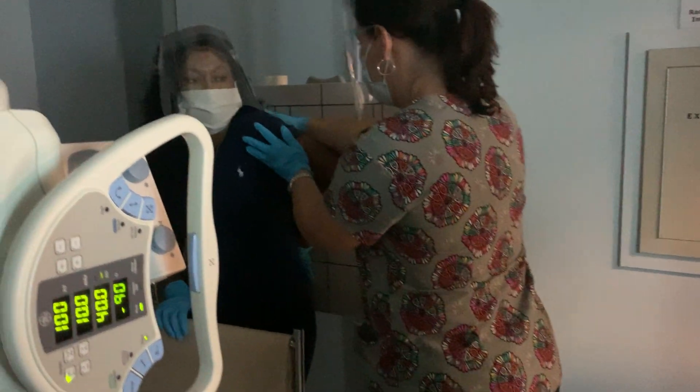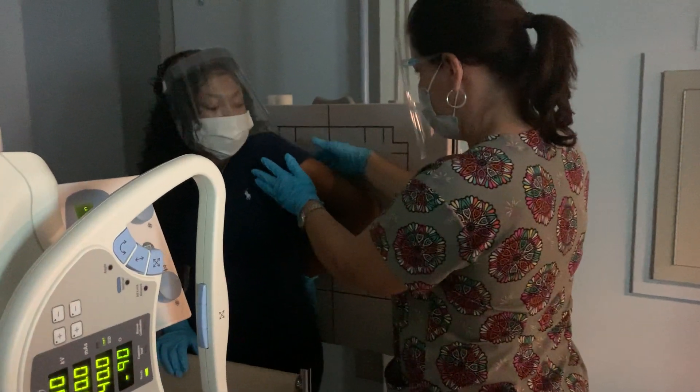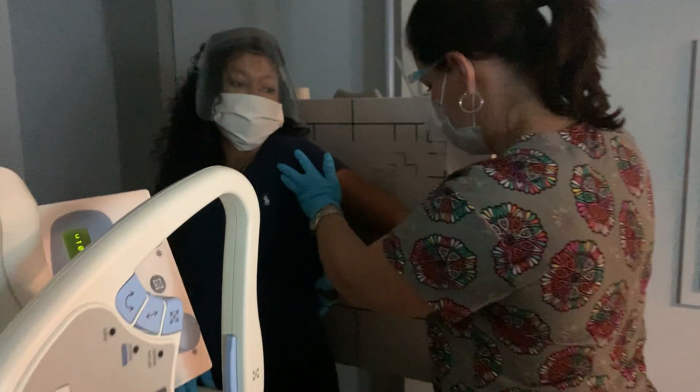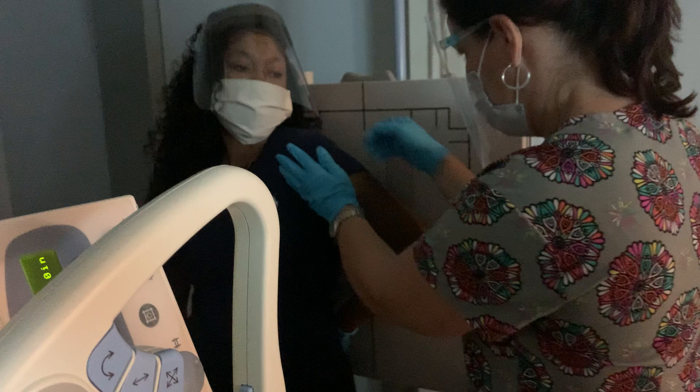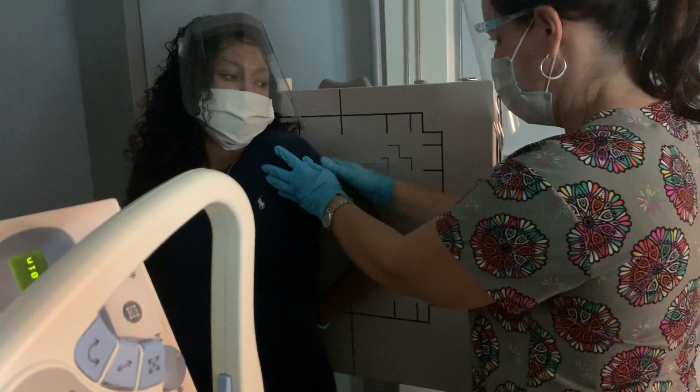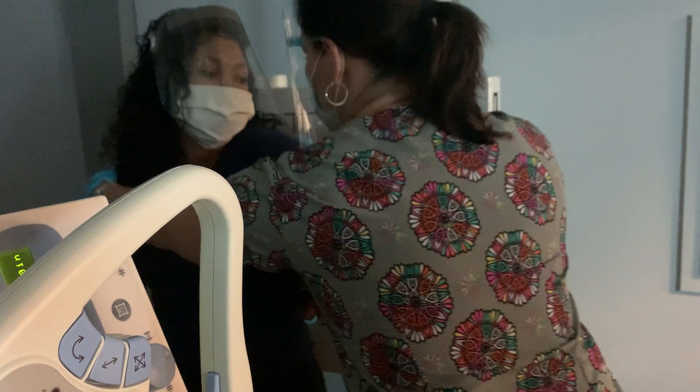Now I need to turn your body. I want your arm all the way up against this arm, but relax your shoulder down. Bring your hand down a little bit further. And then angle your body like this so that we can get your — turn your whole chest.